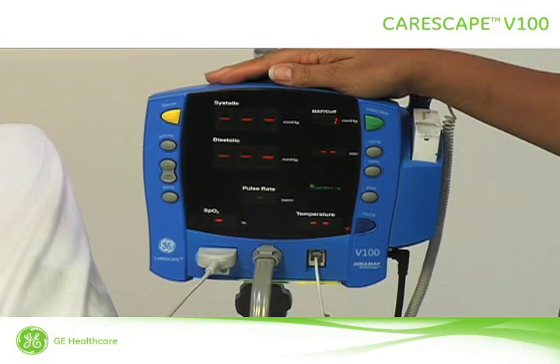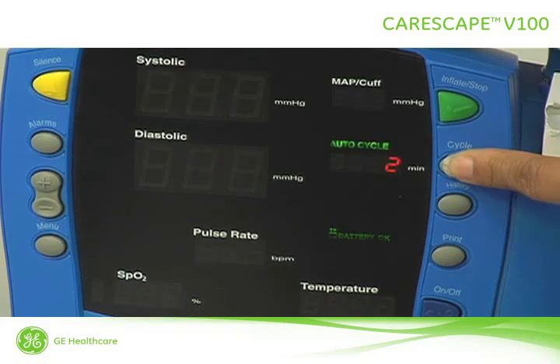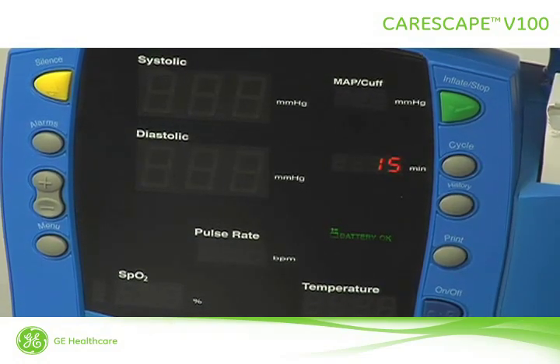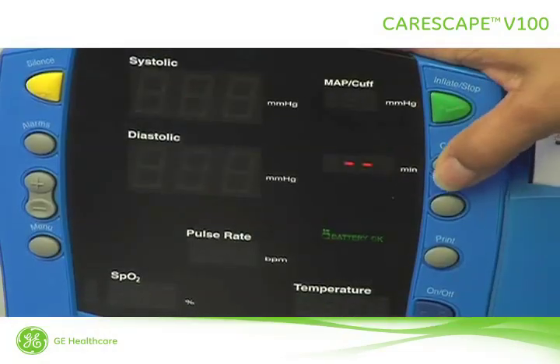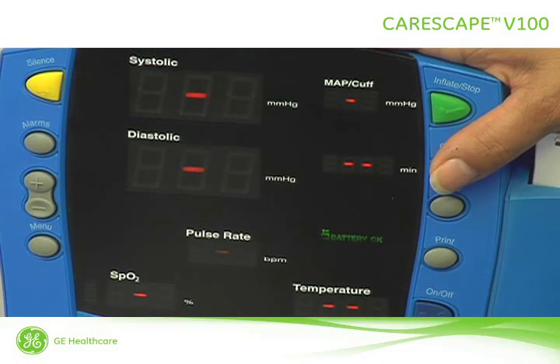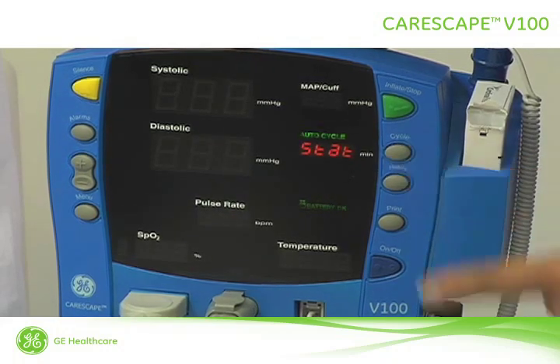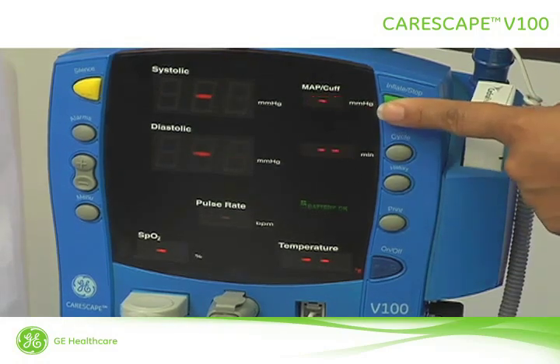In addition to the manual mode, the Carescape V100 monitor has two other blood pressure modes called Auto and STAT. In Auto mode, a blood pressure is taken automatically at the time interval that you select. For our patient, we'll change the selection to automatic blood pressures every 15 minutes by pressing the cycle button until 15 appears in the minute window. To return to the manual mode, continue pressing the cycle button until two dashes are shown. To take continuous blood pressure readings over a five-minute period, press the cycle button until STAT is shown. To stop STAT mode, simply press the green Inflate stop button.